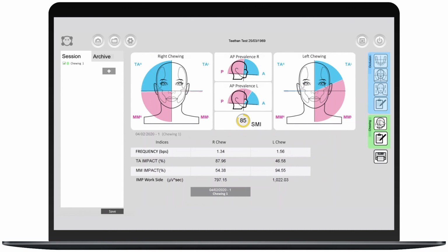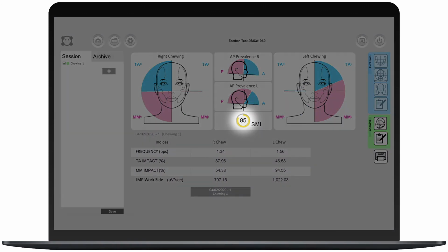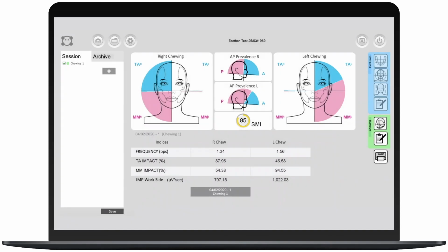Optimal coordination is when the activation of the temporalis and masseter muscles of the working side are evenly distributed, as shown on the right side. In this protocol, the chewing symmetry index is calculated, which is a global index of the neuromuscular coordination. It is a single index that evaluates both sides with an ideal value of 100. The further we move away from the ideal value, the greater the chewing imbalance.